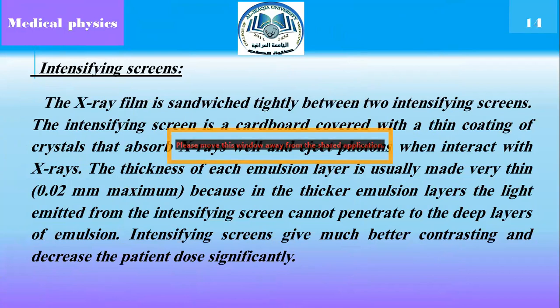The thickness of each emulsion layer is usually made very thin, about 0.02 millimeter maximum, because in a thicker emulsion layer, the light emitted from the intensifying screens cannot penetrate to the deep layers. Intensifying screens give much better contrast and decrease the patient dose significantly.